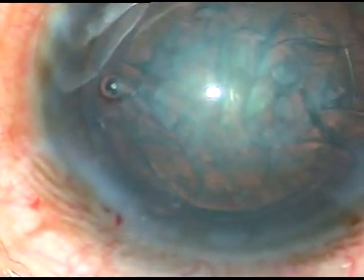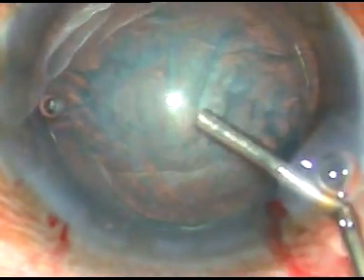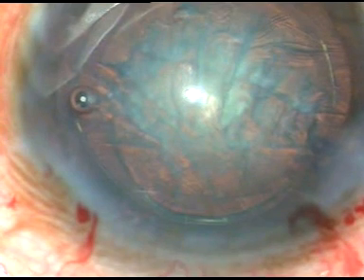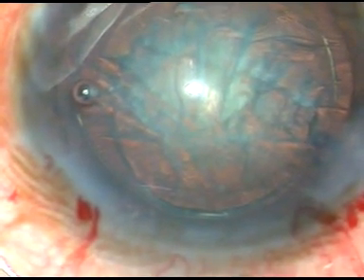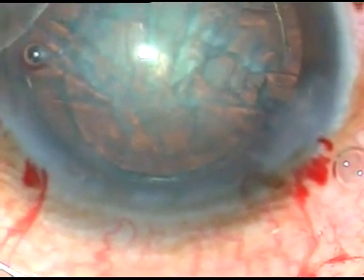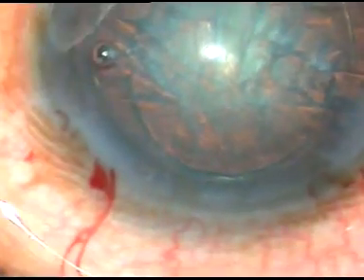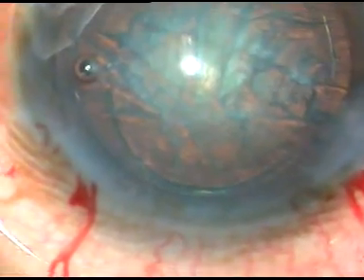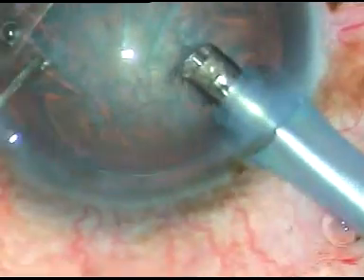Now, as the viscoelastic substance is injected again, we are going to use Oertli Catarhex 3 phacoemulsification in this case. In case vitrectomy is required, if some vitreous strands come through some zonular dehiscence, this machine will be helpful. It has got a pneumatic cutter which gives about 1200 cuts per minute.